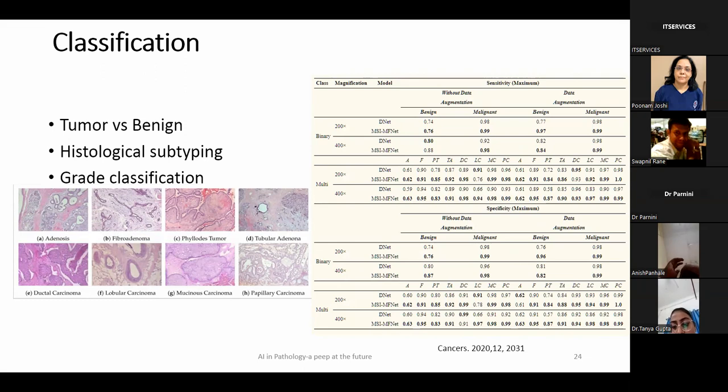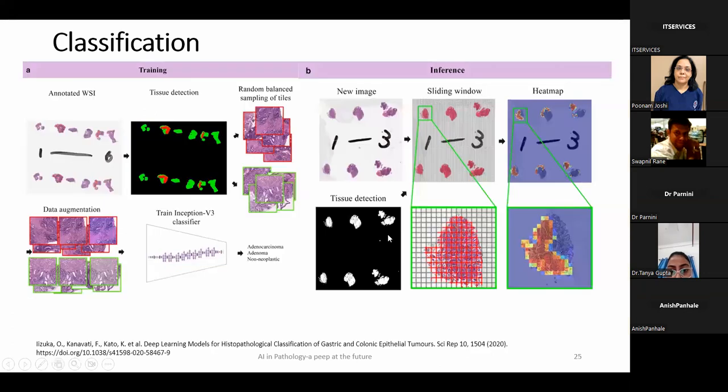But when you start doing this on head and neck cancers and squamous carcinomas, it becomes much more complicated because, unlike the glandular tumors, squamous carcinomas have multiple cell types within themselves. So you have the basal cells, the intermediate, the spinous cells, the superficial cells, and the keratinized cells. There is a lot of variation in cell morphology as they go, and the criteria are much more complex as compared to the glandular tumors.